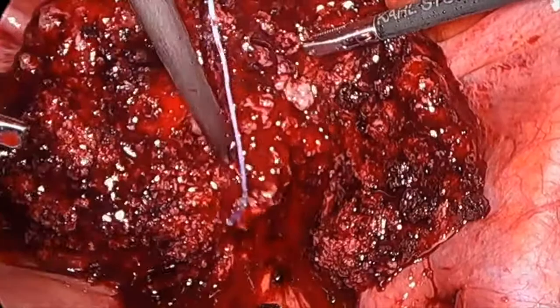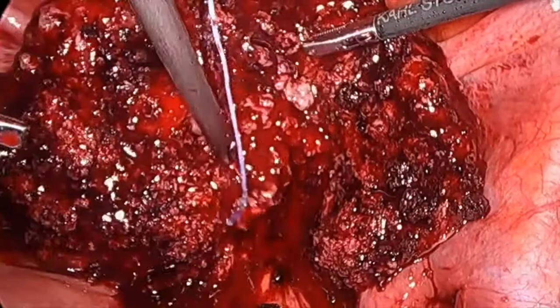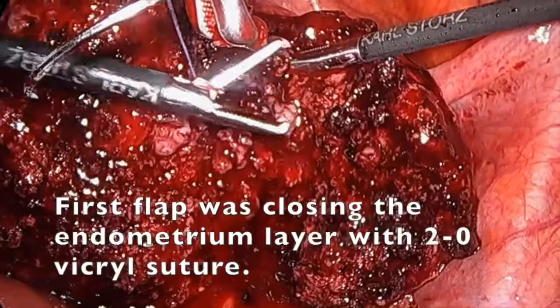Closing the endometrium layer with two zero-vicryl sutures.